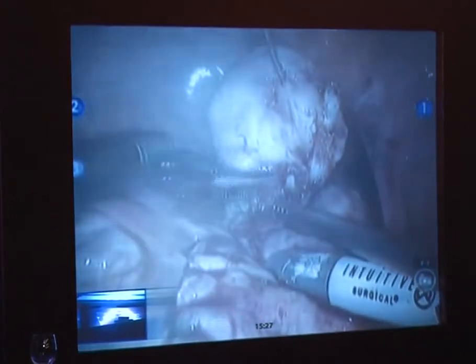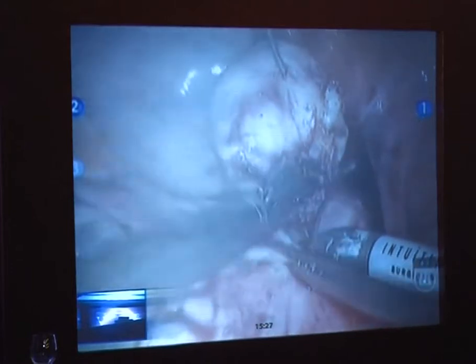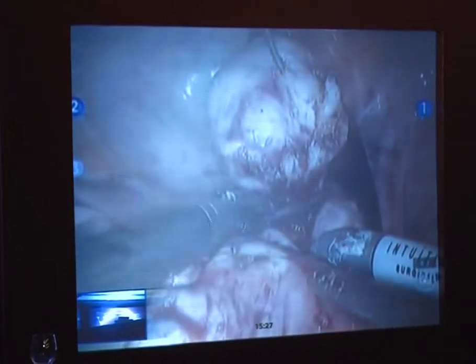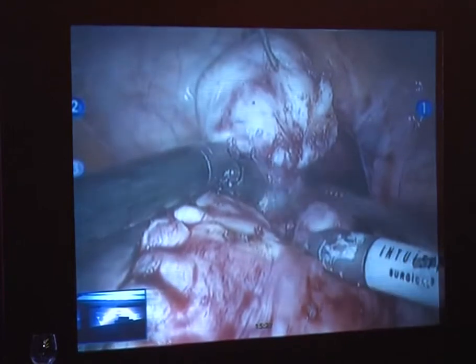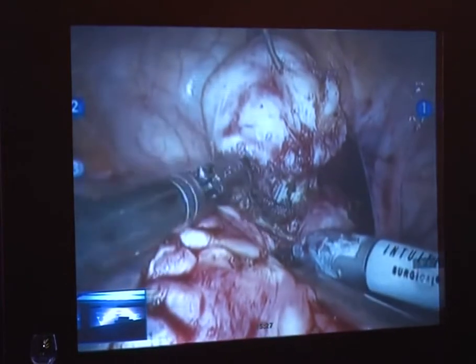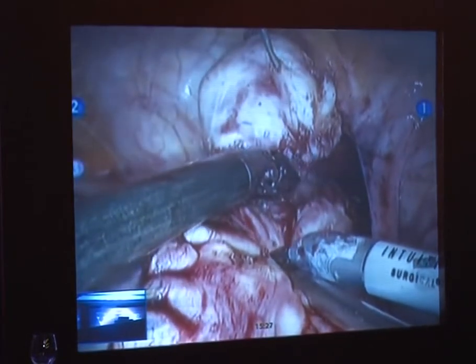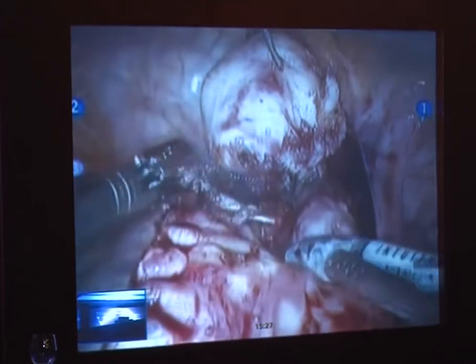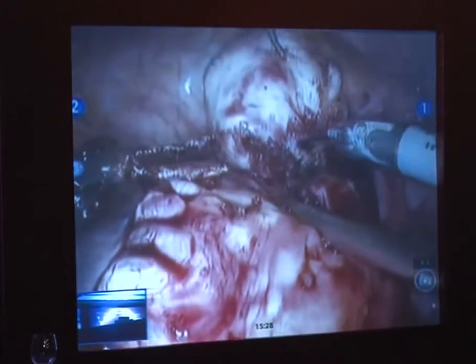So Arnie, you've given us a fantastic demonstration of dissection of fibroids in a variety of different settings in this one uterus, and as we're appreciatively leaving you from Hyderabad, could you sum up what we learned from this case as you're finishing up here? Well, the main thing is proper port placement is important, because if you have good port placement, you're going to be able to have good reach of all the myomas in the uterus. And as you can see, the uterus is looking pretty normal appearing now. So good port placement. The tenaculum is absolutely a fantastic tool for doing myomectomy. Really, without it, you can't do a robotic myomectomy.